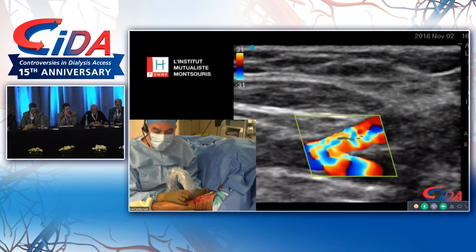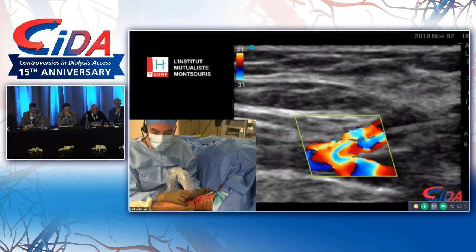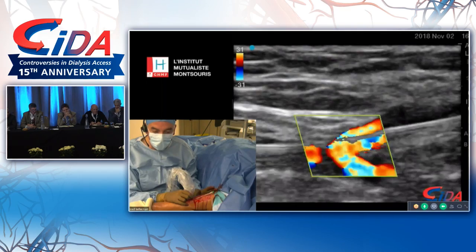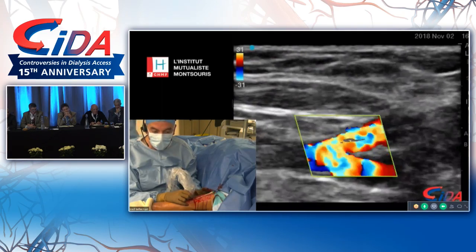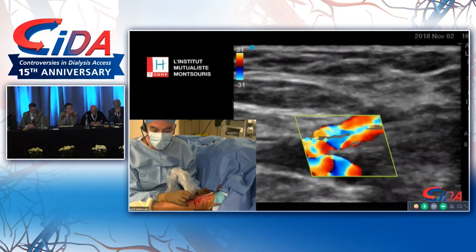contrary to most vascular surgery procedures, where calcified arteries are a big enemy, we didn't have a problem with calcified arteries here, because we have heated pressure that applies on the artery, and this is applicable without any contraindication in calcified arteries. And actually after we balloon them, they stay open instead of having recoil.